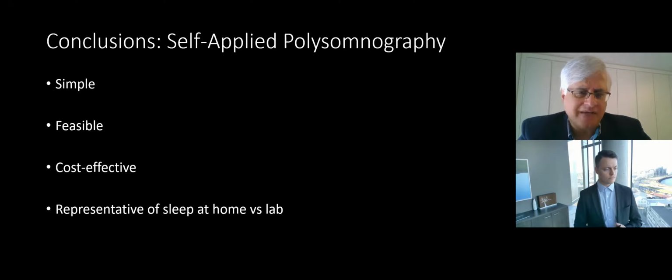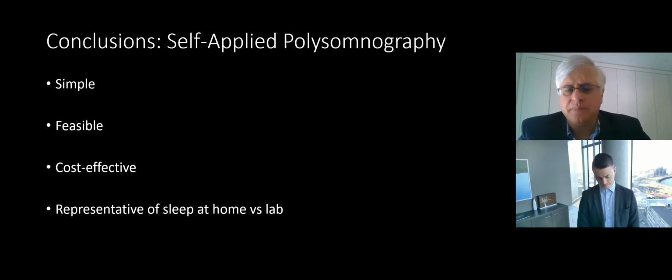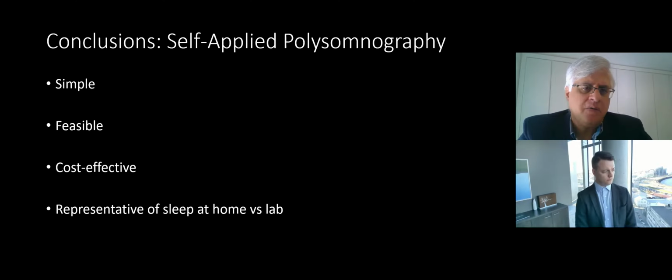Of course, it's cost effective because we're not paying the cost of an in-lab study, which again would have been cost prohibitive for our research attempt in this epidemiological study on HIV infection. And then finally, we're measuring sleep at home. So the conundrum or the problem that we often talk about in the literature about first night effects, of course, is not there. We are actually measuring sleep at home. So for whatever that means, it is as representative as we could get to individual sleep at home.